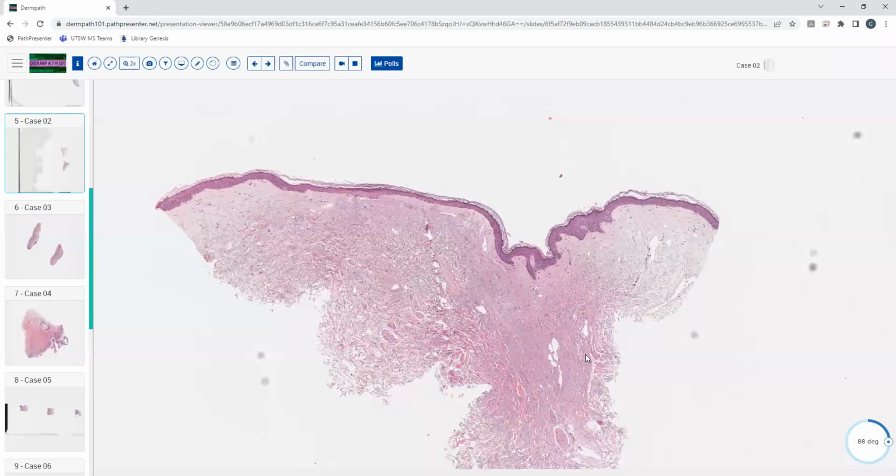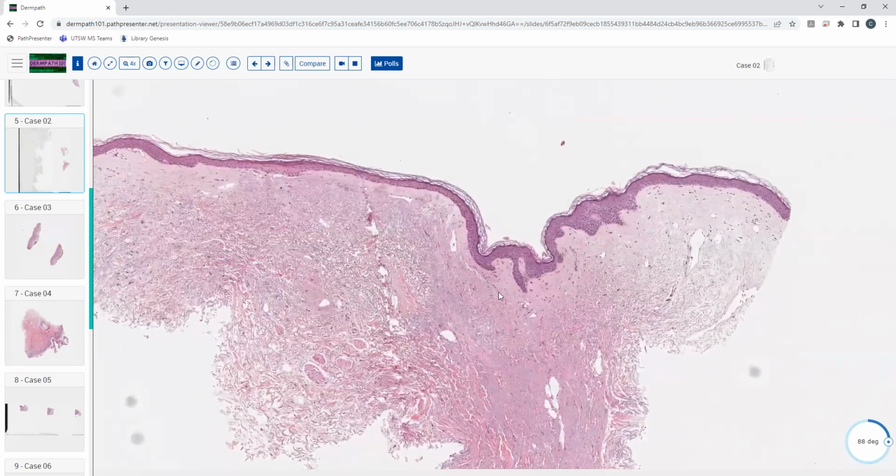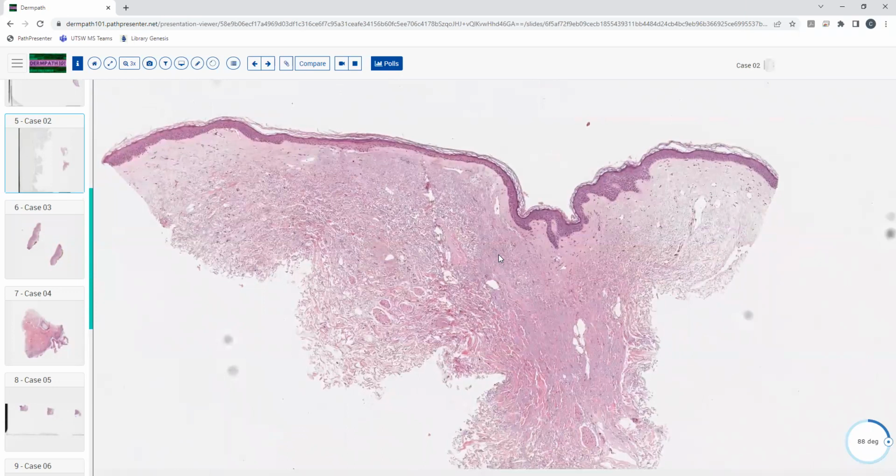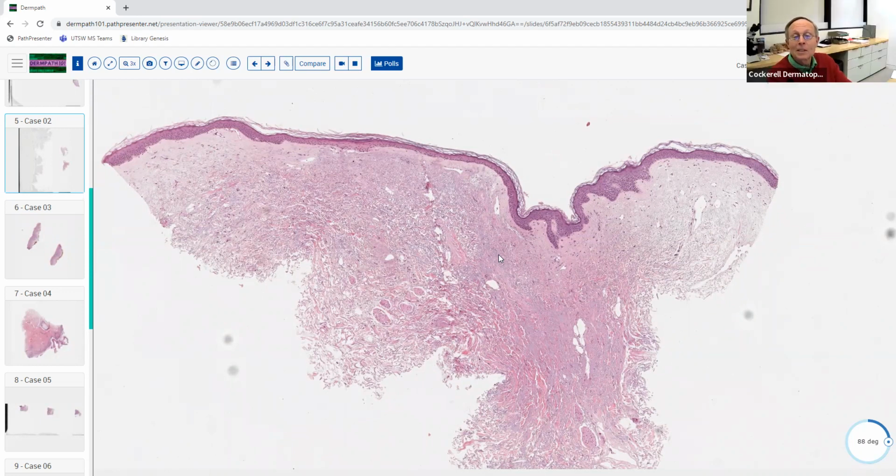But on scanning, it looks like there's a little something going on in the epidermis. It's hard for me to see exactly what it is, maybe some spongiosis or inflammation there. And then on a scale of 1 to 10, where are you going to put the inflammation here? Like dermal, maybe, or maybe about a 1. I mean, it's hardly inflamed at all, right? Yeah, not much inflammation. And so when you see that, that kind of raises a differential diagnosis. If you look at somebody who says, well, it doesn't look like there's very much inflammation here, it certainly doesn't look like a neoplasm. So you have to think about the 9 inflammatory patterns, and you can wipe out about 8 of them pretty quickly.